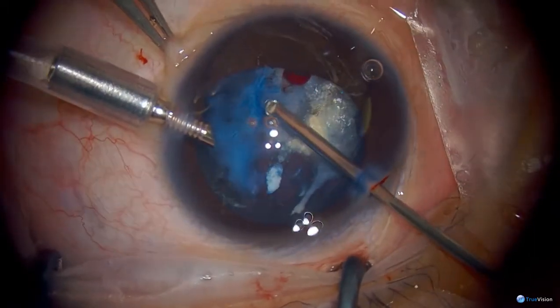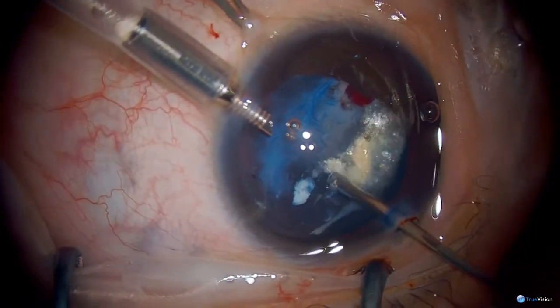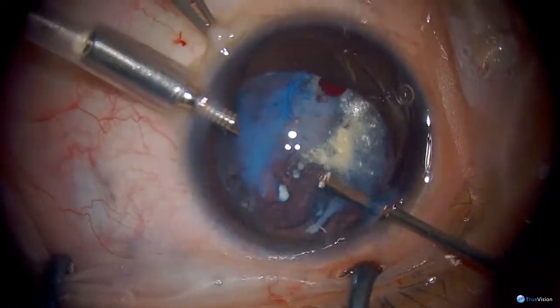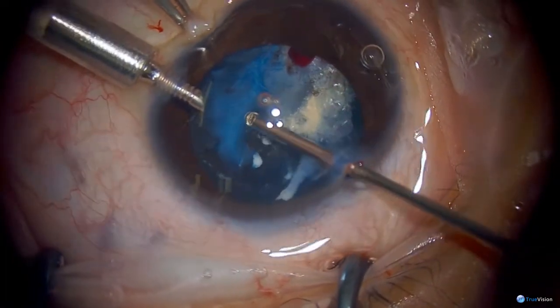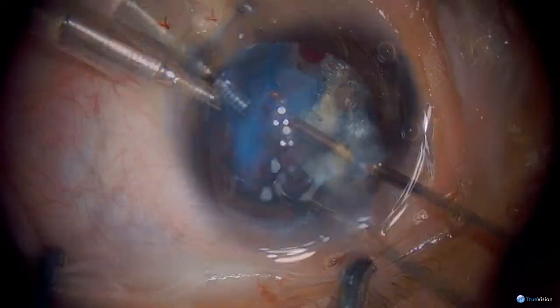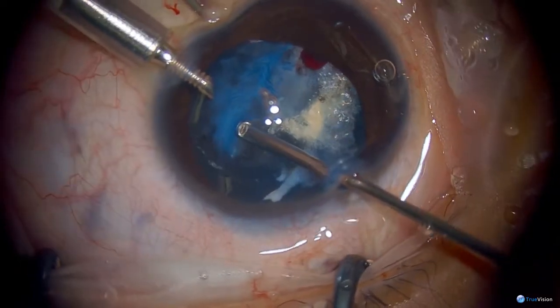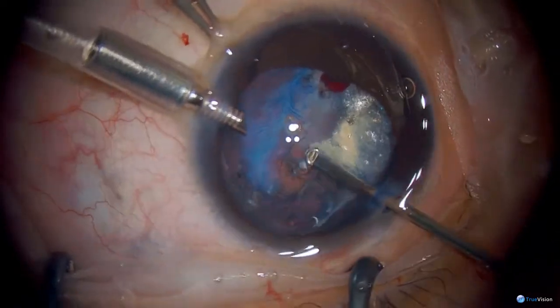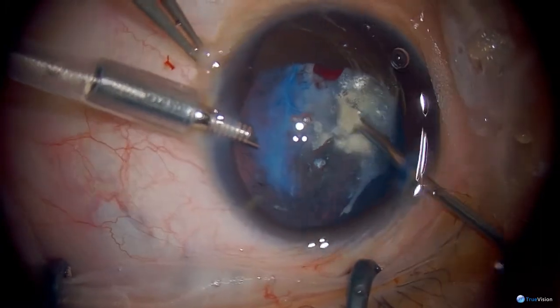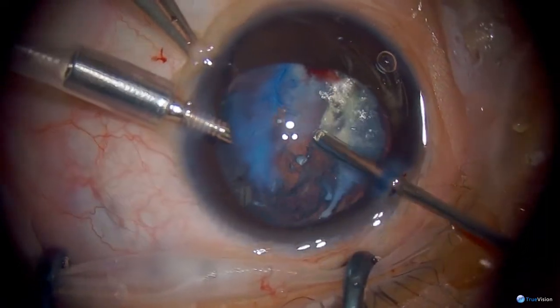As you can see, there's not much room here. This is the posterior capsule just behind me. So normally you wouldn't remove the capsule like this, but because the anterior and posterior capsule have been fused, it's okay to do it this way. You can see there's a fold here in the capsule. Some of this material is very calcific, almost crystalline material here that's just coming loose. Yeah, it looks almost like crystals.